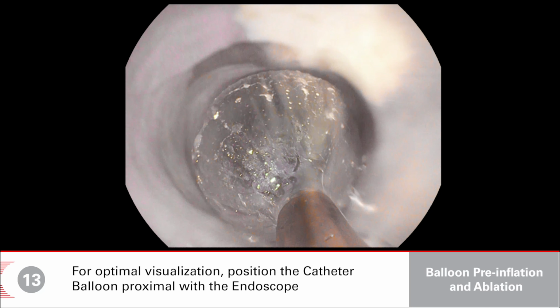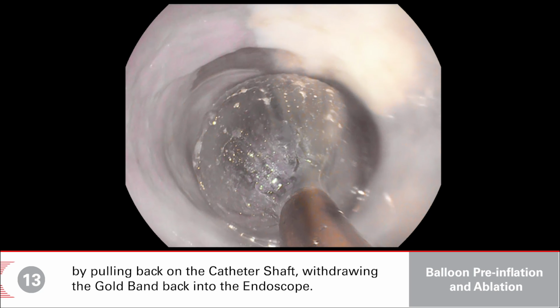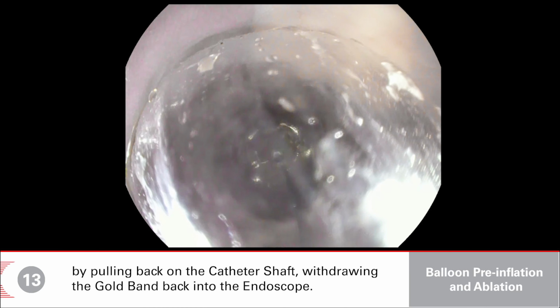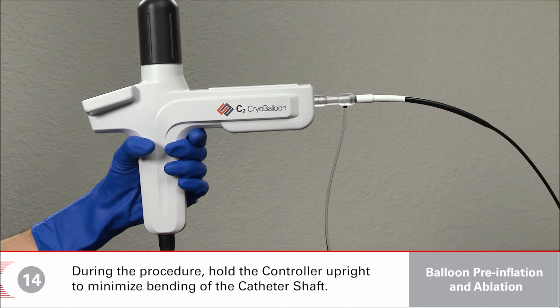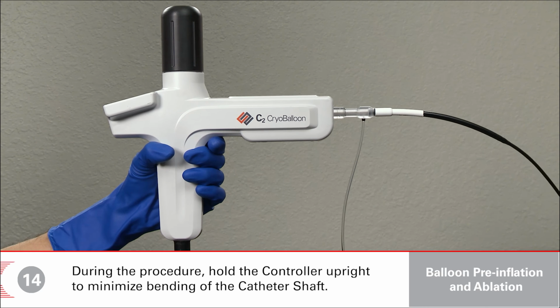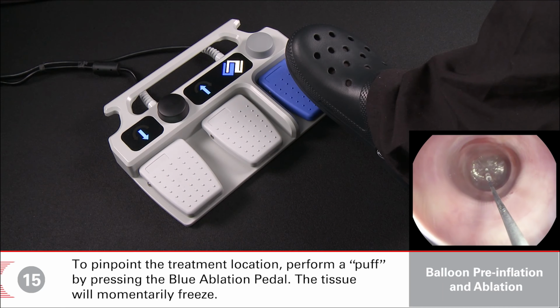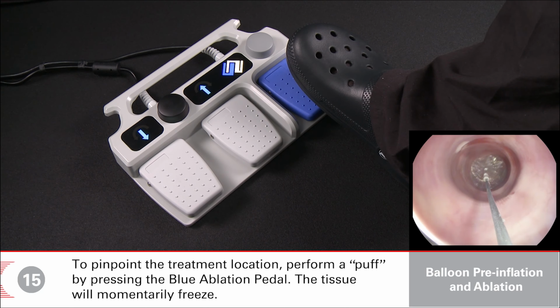For optimal visualization, position the catheter balloon proximal with the endoscope by pulling back on the catheter shaft, withdrawing the gold band back into the endoscope. During the procedure, hold the controller upright to minimize bending of the catheter shaft. To pinpoint the treatment location, perform a puff by pressing the blue ablation pedal. The tissue will momentarily freeze.